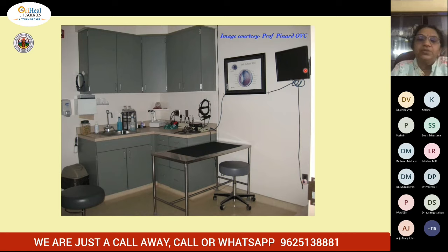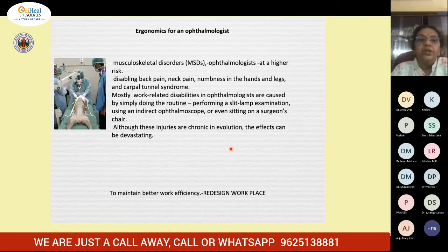This indirect ophthalmoscope is connected to the television so that you will be able to teach the students as well as the clients the structures which you actually see with the indirect ophthalmoscope. There is no TV connection to the direct ophthalmoscope. That is very difficult. Only with the indirect ophthalmoscope have I seen the images projected for viewing by the other people around the examination area.